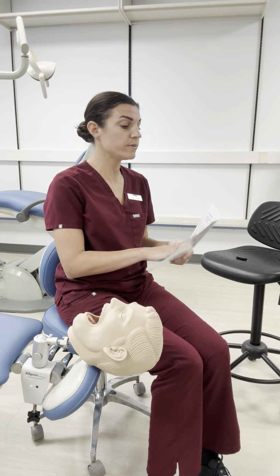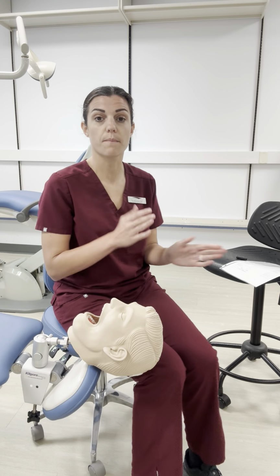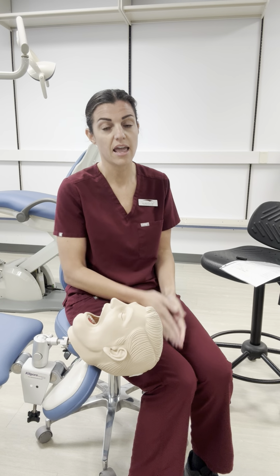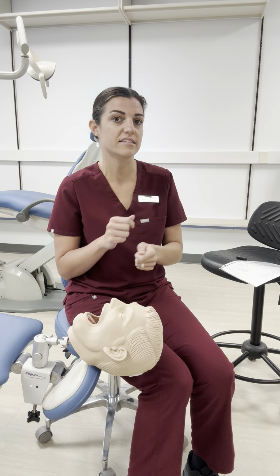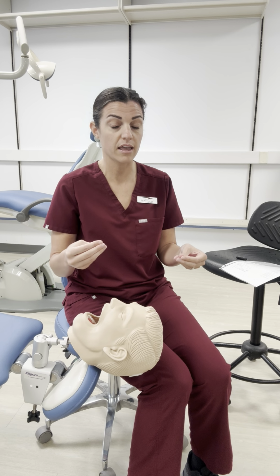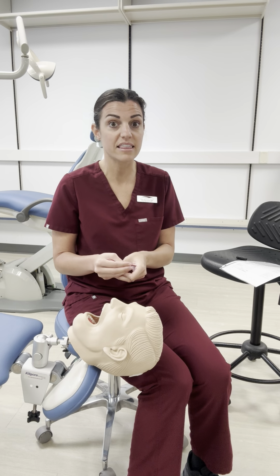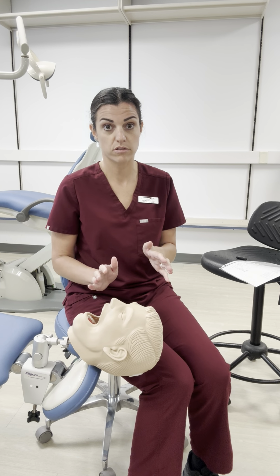So this is going to be true for dental hygiene in general, right? So the correct positioning that you want to be in. As you get out into practice, you might feel more comfortable with indirect vision and can sit in different spots. But for now, this is what's going to be best for you ergonomically, and that way you can see things directly or have better access to areas of the mouth, okay?